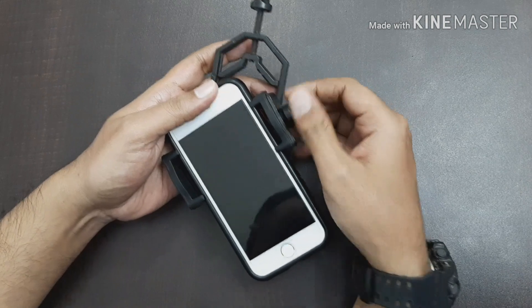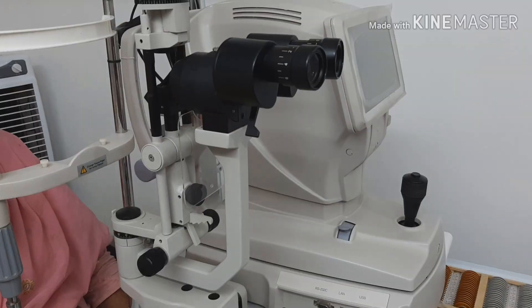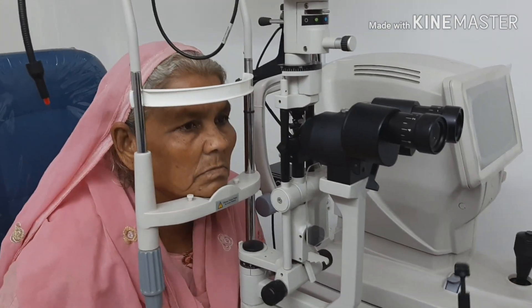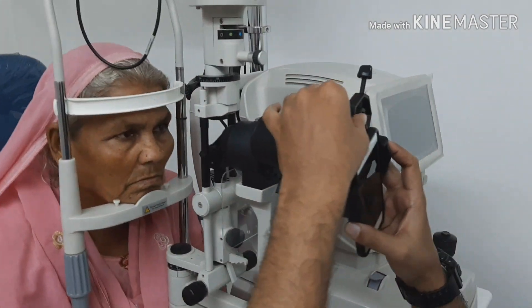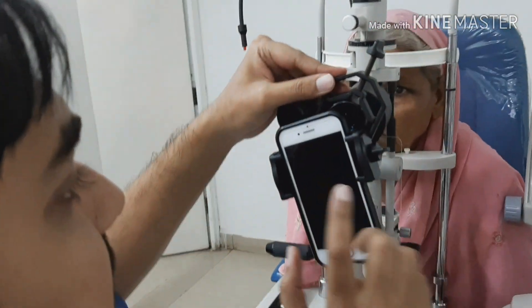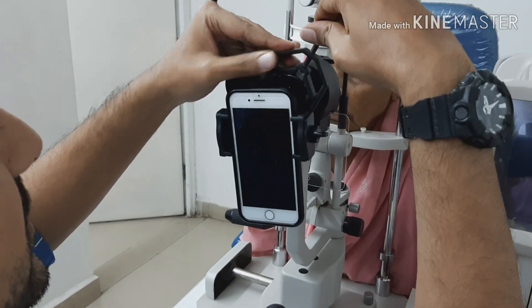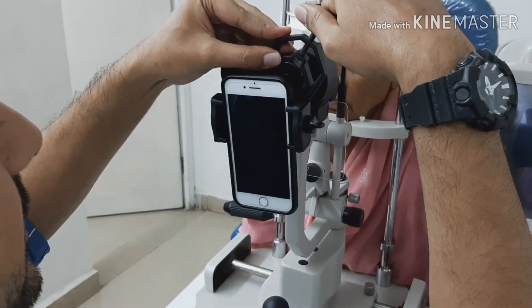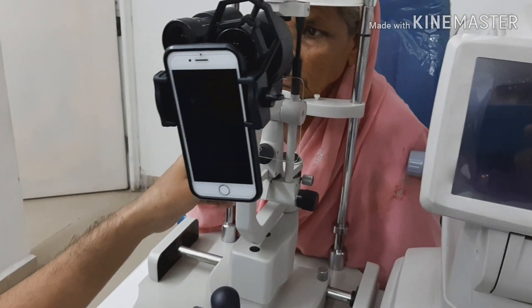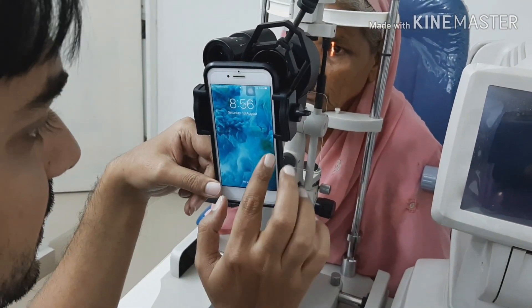Once you've tightened the knob, check that your smartphone does not slip off the adapter. It has rubber cushioning on both sides, so it should stay secure. Then place the adapter onto the eyepiece of the slit lamp and tighten the knob on the eyepiece so that the whole adapter does not fall off.